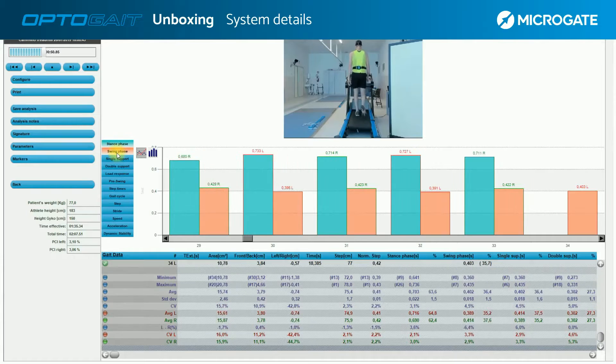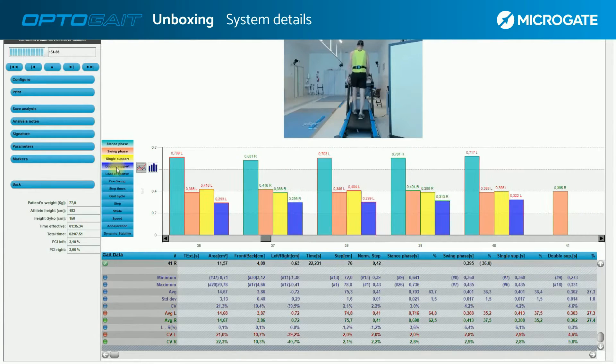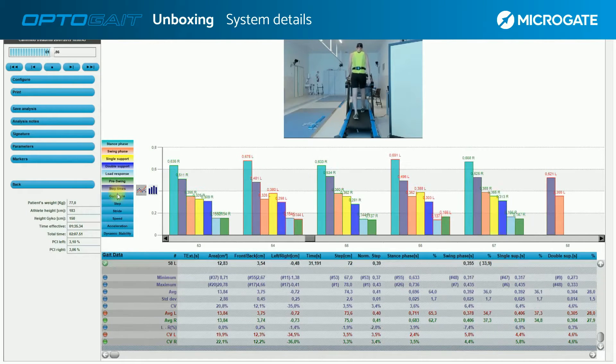The LEDs interpret signal interruptions that can be displayed in the software in real time. In this test, for example, we can see an analysis of the walk in its different phases: stance phase, swing phase, single support, and double support.